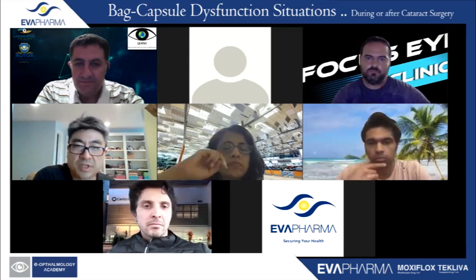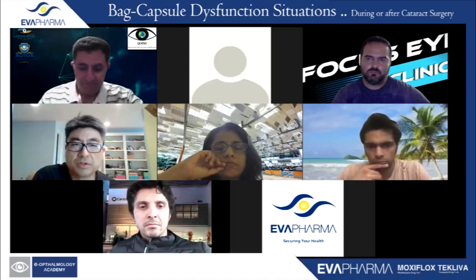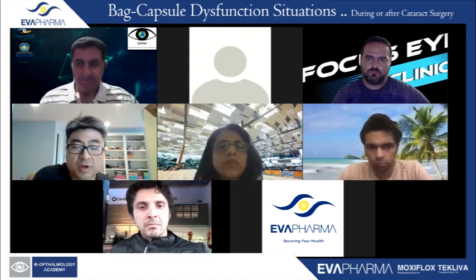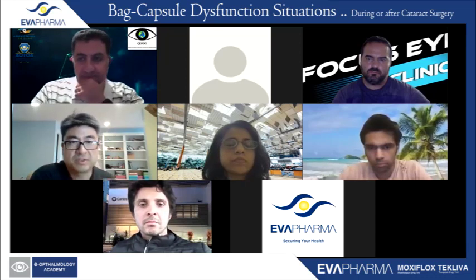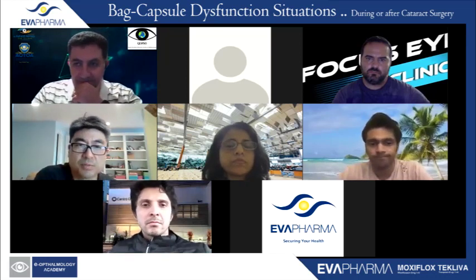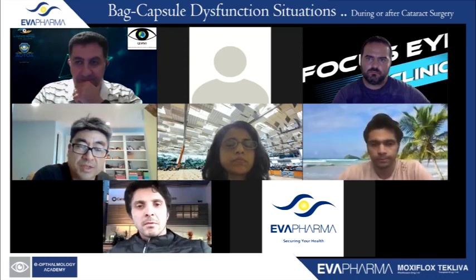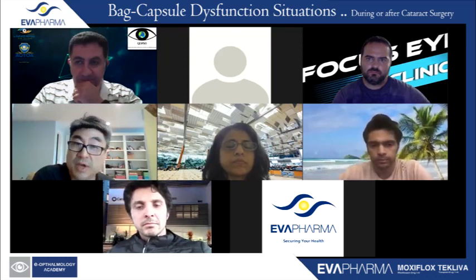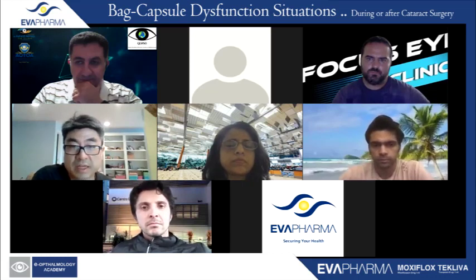Regarding the question of the 27 gauge needle, I can understand wanting to use a 27 gauge needle. It should work. The concern has always been that the sclerotomy size is going to be larger and you might have the flange slip through it. But I think it's reasonable to do it that way. To be honest with you, since I've had access to the 30 gauge thin-walled needle, that's all I've been using. So I can't really comment beyond that.